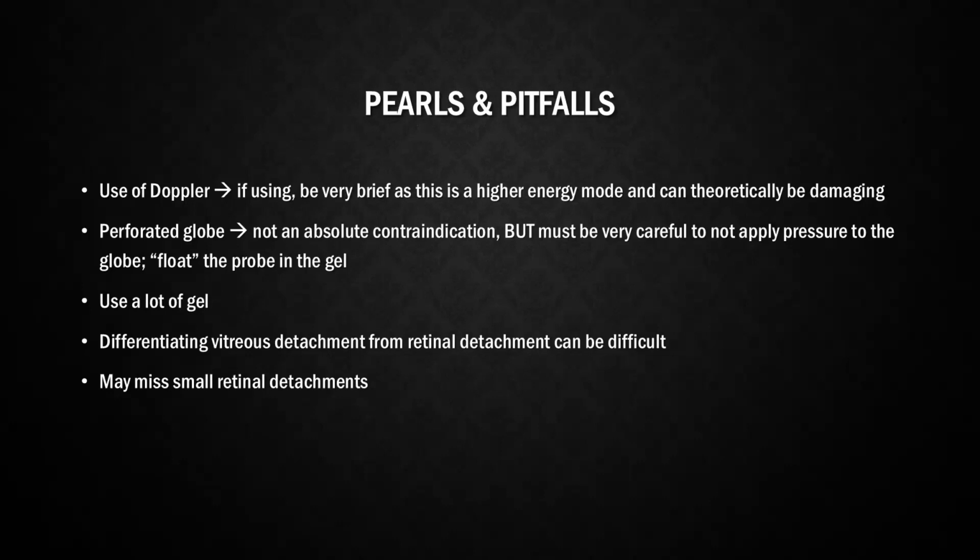And then finally, you might miss small retinal detachments or other pathology. So make sure that you increase your gain. You use your extraocular muscles in order to visualize every area of the eye.